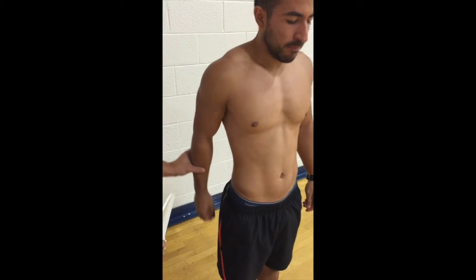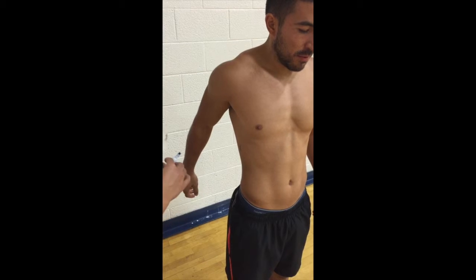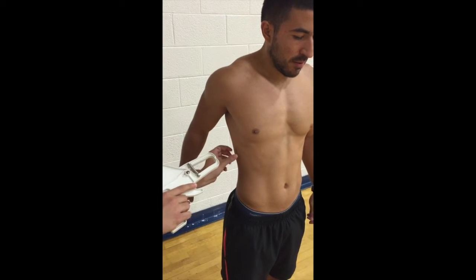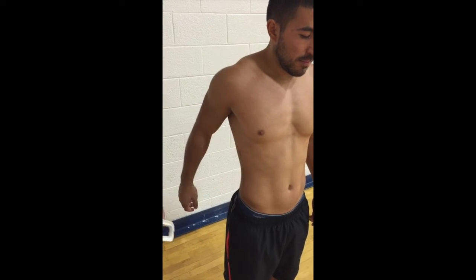The mid-axillary skin fold is a vertical fold on the mid-axillary line at the level of the xiphoid process of the sternum. An alternate method is a horizontal fold taken at the level of the xiphoid sternal border in the mid-axillary line. The best way to find the mid-axillary fold is to have the patient move their arm back.